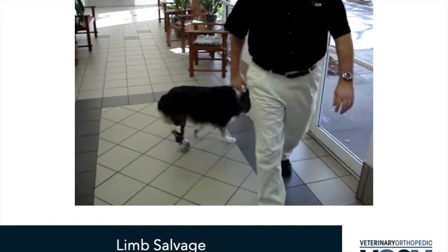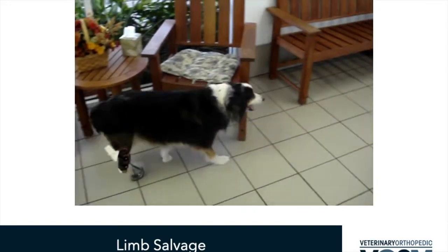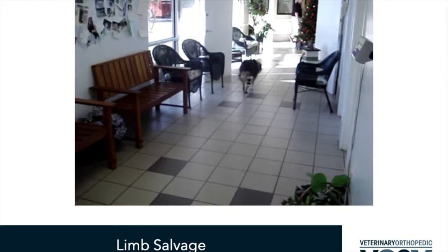You can see the prosthesis is on. Now this patient's been working with a rehab therapist, and we're to the point where we're fairly comfortable. You can see we're going to start to go almost into a trot here, using it fairly well.